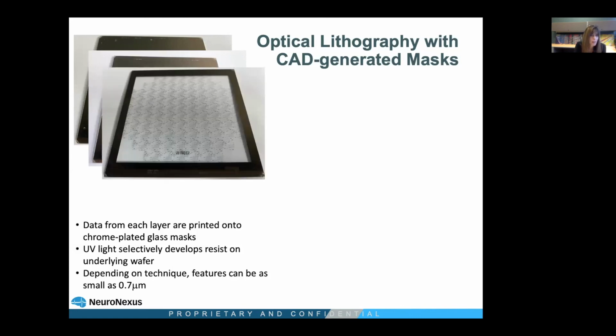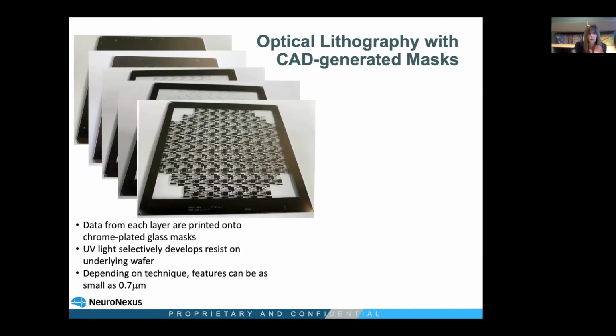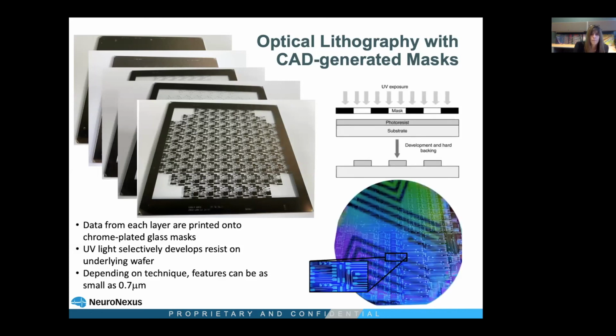And bond pad mask. Those are the iridium site, or the site mask, and this is the actual outline of the probe. So 5 masks used to make a probe. There's a 4-inch wafer shown with probes on it, and up on top of that you see how the mask is used. It's put in a mask aligner, exposed from the top with UV light. The pattern is transferred to the resist down here, and then your etching is performed, and you end up with your thin film.